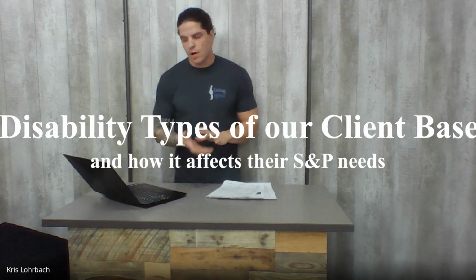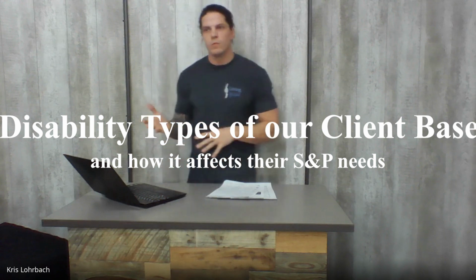Most of our clients are going to be within these few disabilities. And Andrew, you can chime in if you think of any I missed here. Spina bifida causes lower extremity paralysis and some other things. Non-ambulatory elderly clients have specific needs and cushions.